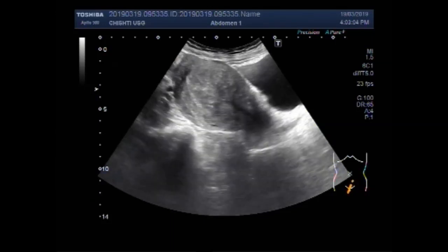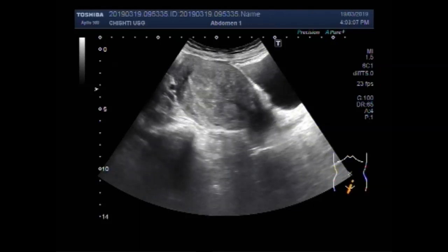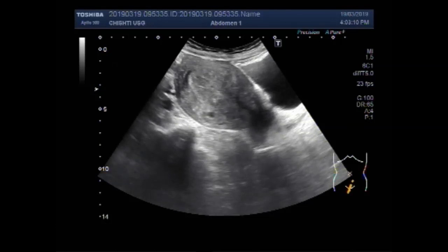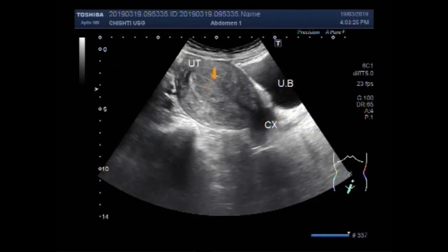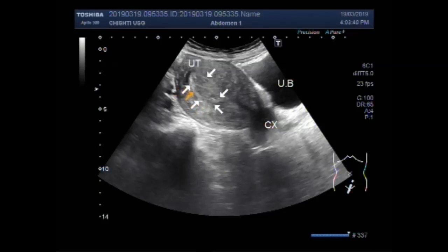You can see this is the uterus and urinary bladder, and an evenly ecogenic mass is seen in the distal portion of the uterus. This is the cervix and urinary bladder, and this evenly ecogenic mass is seen in the distal portion of the uterus. This is a polyp.